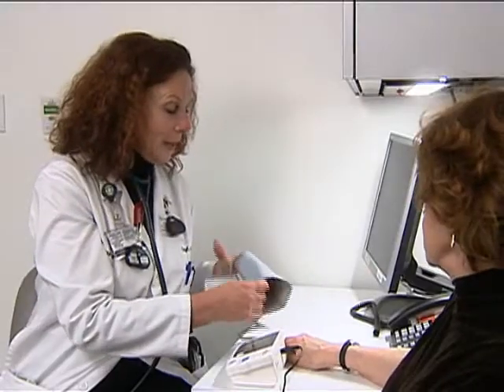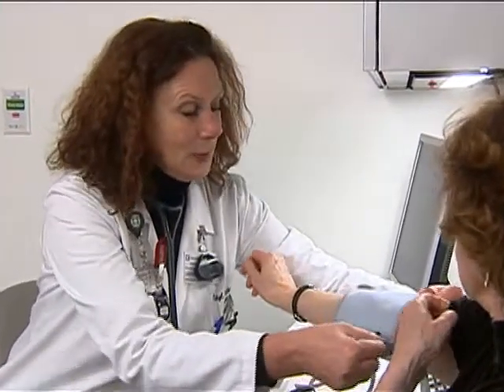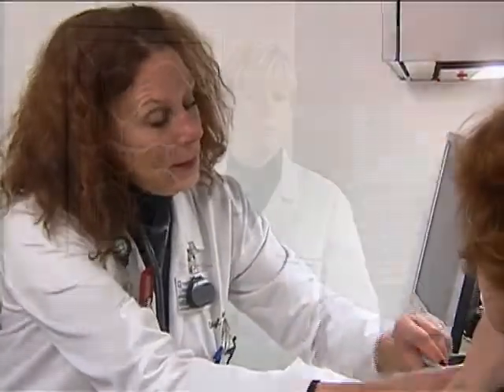You will have to make an appointment for a nursing visit in addition to the physician office visit on the day you are having the device checked. Before you use the device, be sure to read and follow the instruction manual. And keep in mind that there are several factors that can cause your blood pressure to rise temporarily.